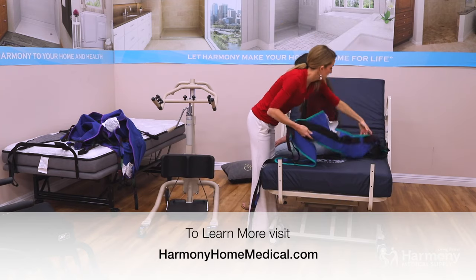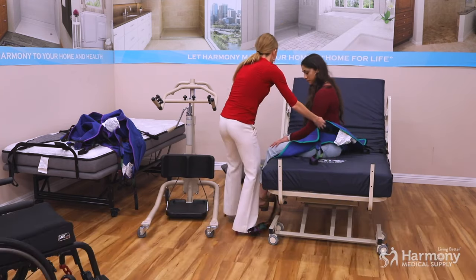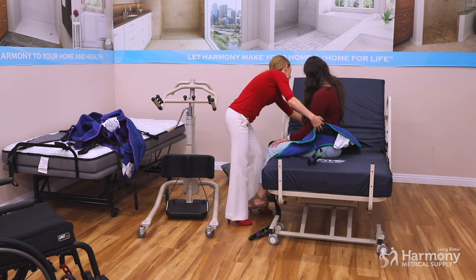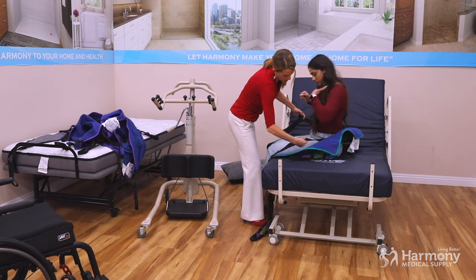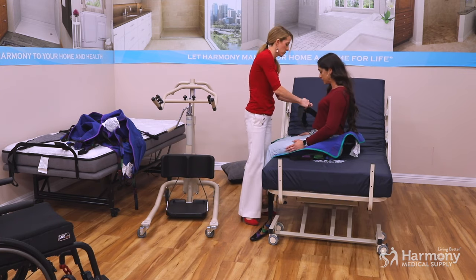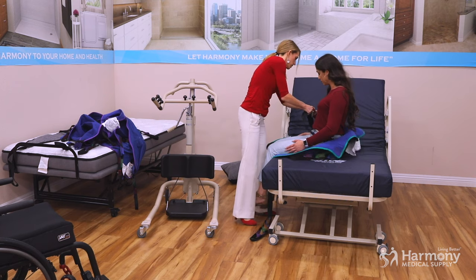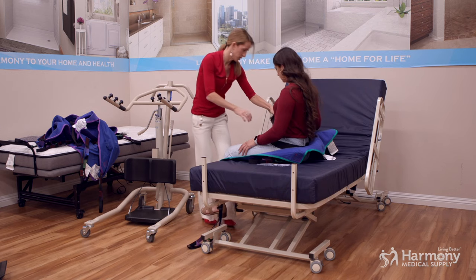With this lift, we'll put the sling around the patient's back — easy. Then we attach the belt. Some lifts have these and some don't. We'll shorten this one up; it helps to keep the lift in place around the patient's waist.